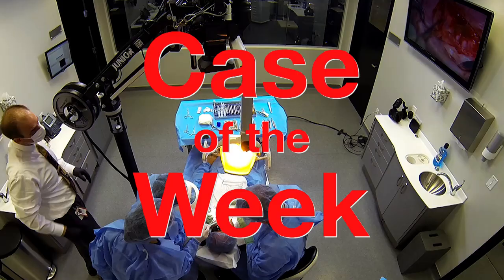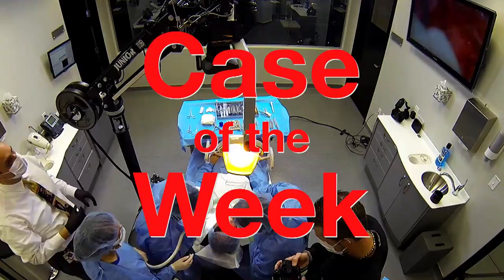Hello, and welcome to Chair Side Live. I'm your host, Megan Strong. Thank you for tuning in today. In this episode, Dr. Marishan is presenting a combination crown veneer case on teeth number 7 through 10. She's placing Bruxer Anterior for its strength and durability and its aesthetic appeal. Let's check it out.